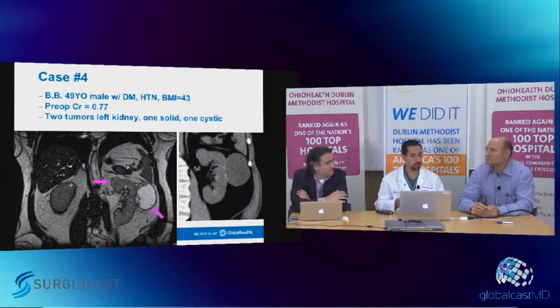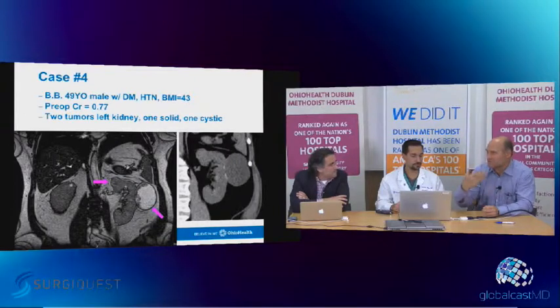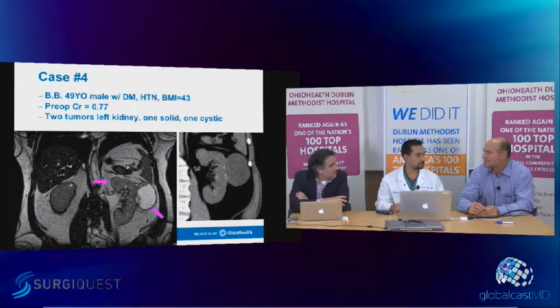So you would clamp the artery and then resect and reconstruct both on the same clamp? Yeah, I would. Retro? No, trans. I mean, I don't have axial, really. I really have to see with the axial. With the coronal, it's hard for me to always predict which way, trans or retro. Yeah, so generally multiple tumors you will do retro. Yeah, we've done multiple tumors retroperitoneally, but they've all been posterior based. Yep. Okay. Lee, would you do anything different here? Would you clamp the artery and do both of these on clamp, reconstruct both?